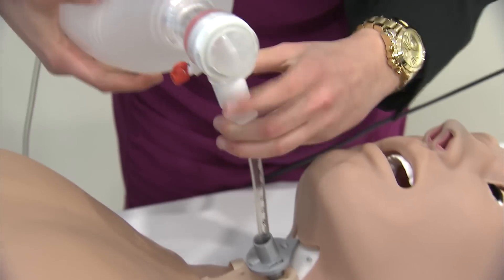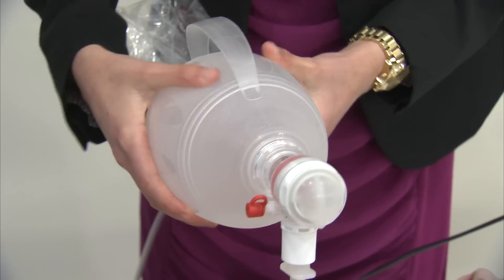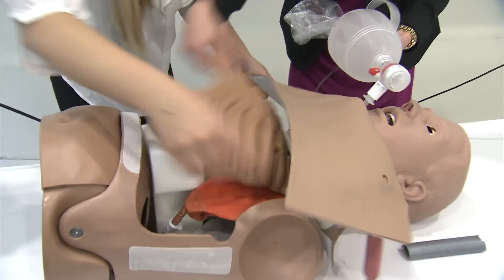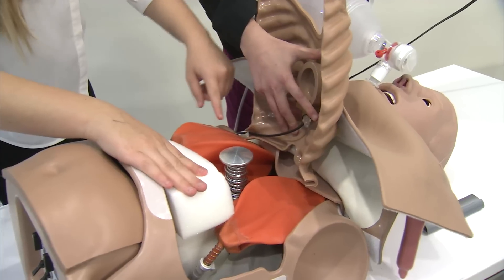And then attaches an Ambu bag to ventilate. We can open up the chest of the simulator to see the lungs inflating when the ventilation occurs.